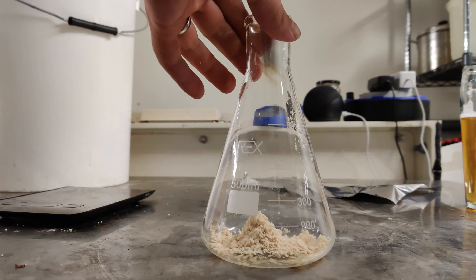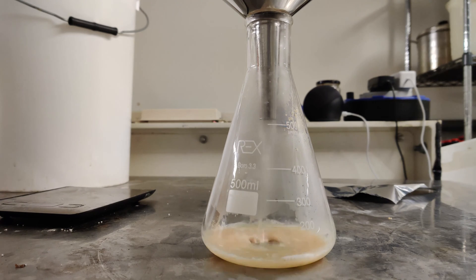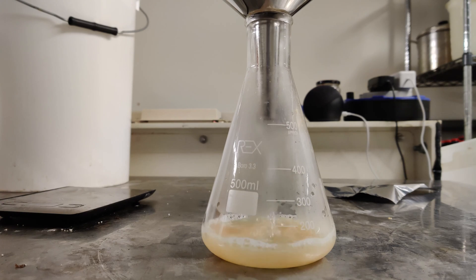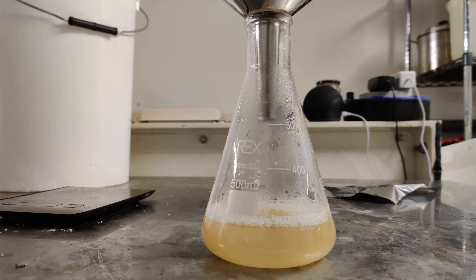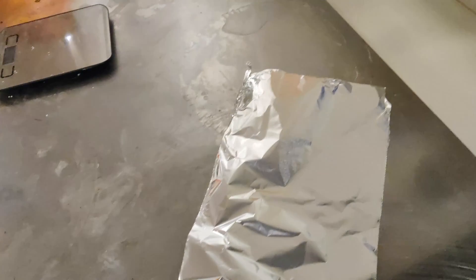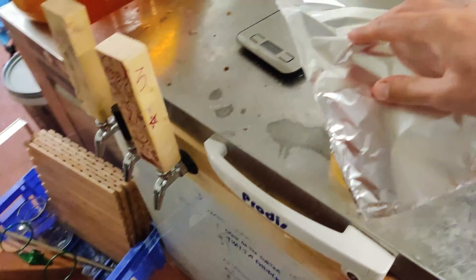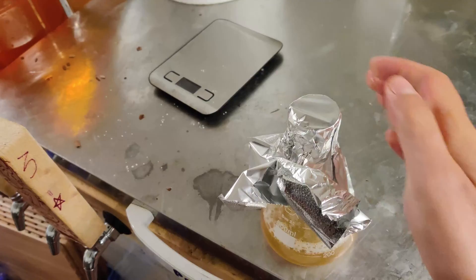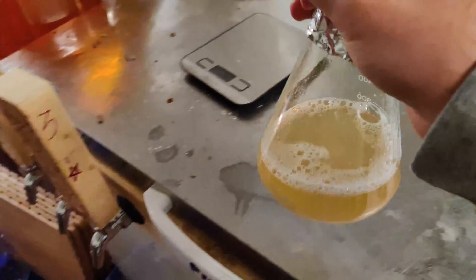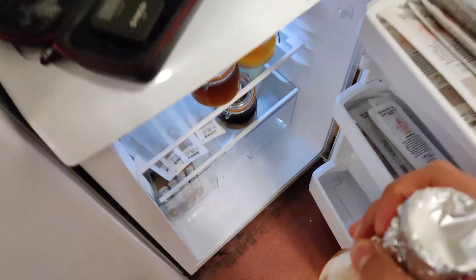Empty the water from the flask and boil the kettle again. Using a funnel, pour the DME into the Erlenmeyer flask — it might need a bit of a shake to get all the DME through — then pour in 200ml of freshly boiled water. If the measurements aren't exact it's not detrimental as long as you're close enough. DME is very sticky and tends to stick onto things, so I was just using the water to dislodge it and get it into the Erlenmeyer flask. Then take a square of foil, spray it with chemsan solution, and cover the flask. Give the flask a swirl to dissolve all the DME and put it in the fridge to cool down to a temperature that you can pitch the yeast at. That jar of yeast in the fridge is the yeast I'm going to pitch later today.